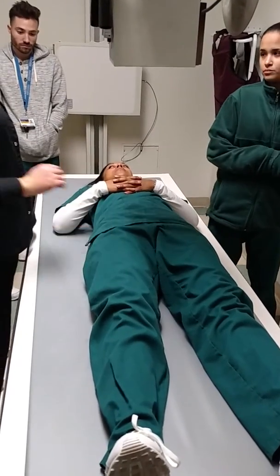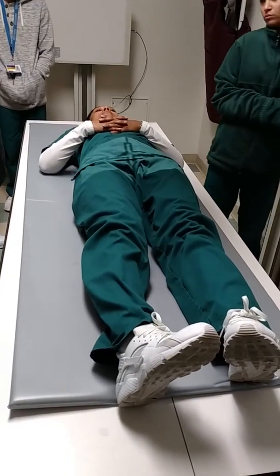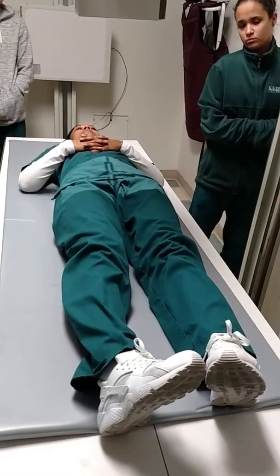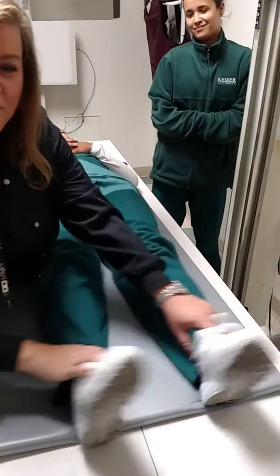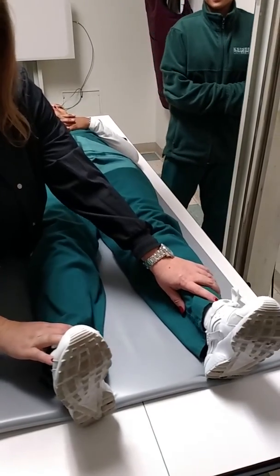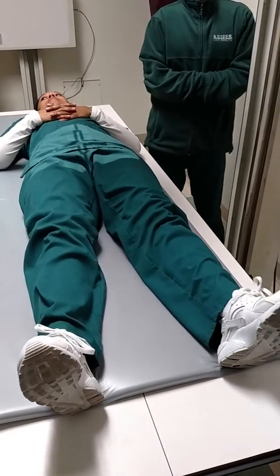Oh, well, before I shoot it, what do I got to do? 15 to 20. I was telling the last group, that's an automatic fail. So be very careful with that. I was also telling the last group that I'm sitting right there in the chair. I can see what you're doing. You're like this, the patient's getting, okay, hold your breath, and then you start doing it. Should it be more like this? Or closer? It's 15 to 20. It's not craziness. Can we tape?